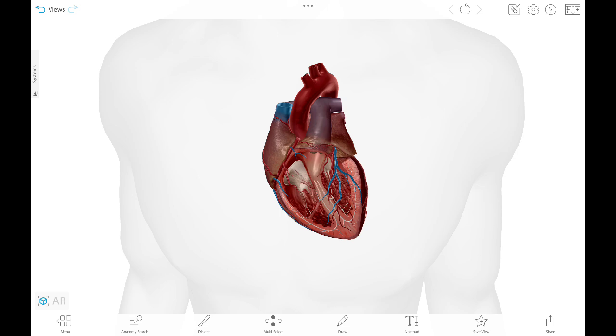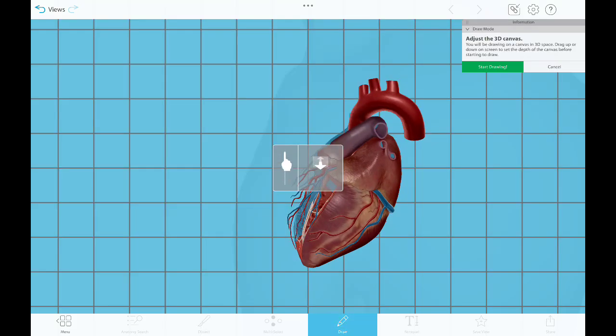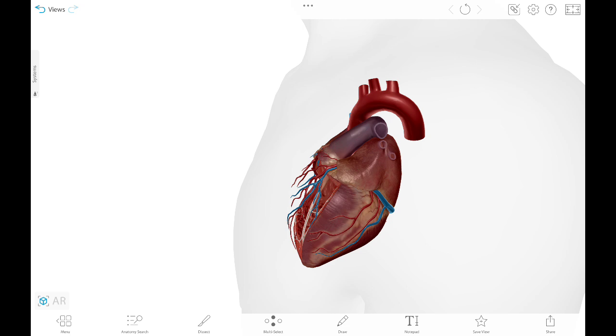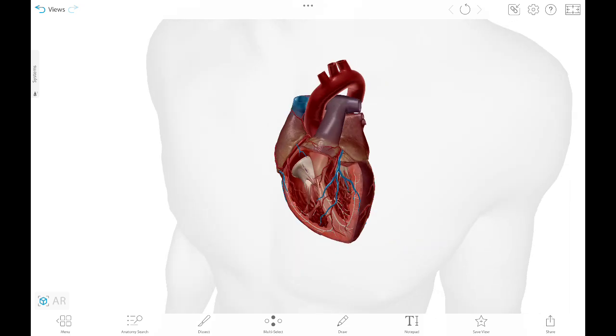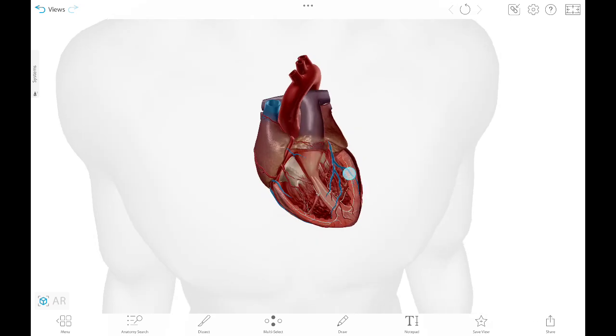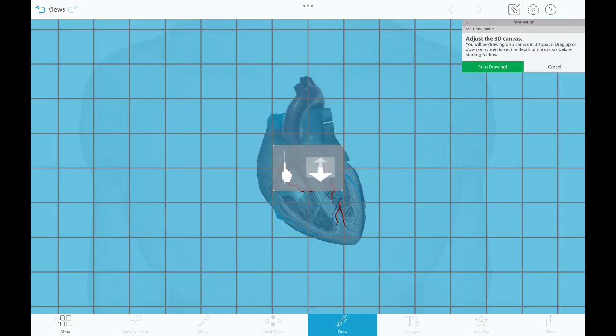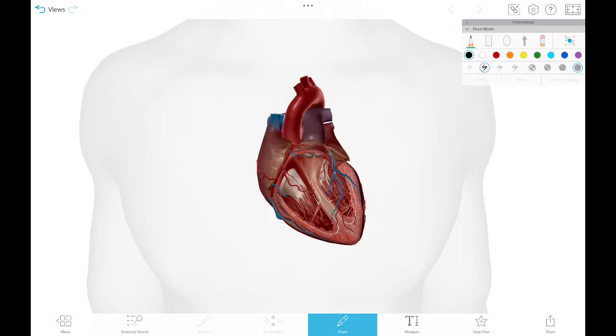For example, we want to cover the left side of the heart. For that, we have to place our leads around it. We have to cover the anterior side of the heart, so for that we need to place the leads here. We want to study the right side of the heart. So basically, we want to cover the axis of the heart in a way that it covers every part. Therefore, my dear, the leads of the heart are placed on two planes.